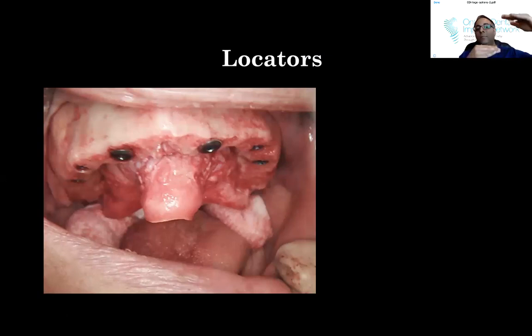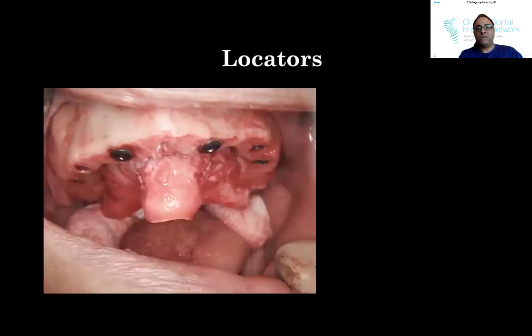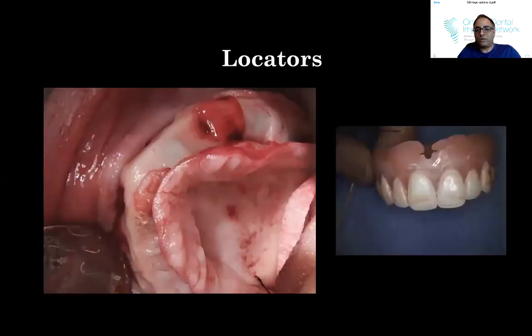Using implants with mounts, okay, mounted implants really help when you're doing multiple implants. And the Hyosin implant, you can order mounted or non-mounted. I was trained on non-mounted. So this is a case, again, with adequate reduction, good AP spread, good spacing of the implants, with some PRF membranes on top. But again, I use the denture as a guide.